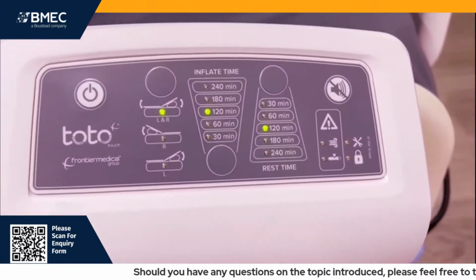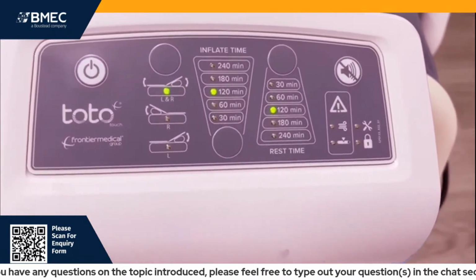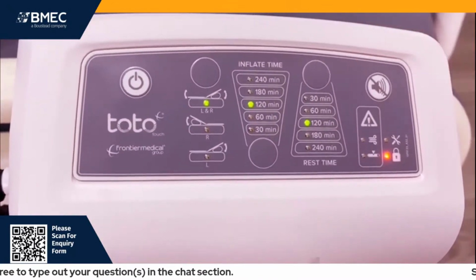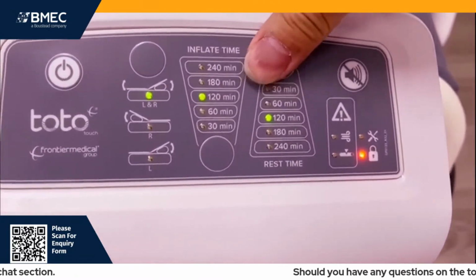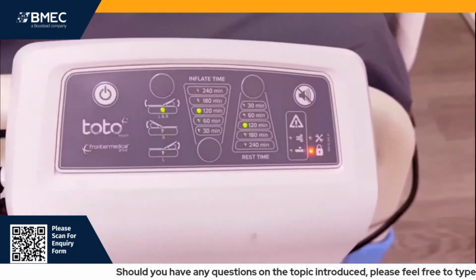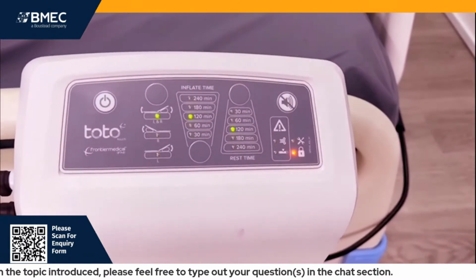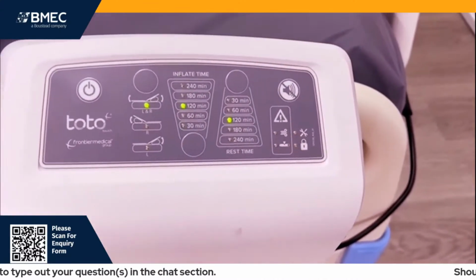It happens when the pump detects an air leak and they will show it, the alarm will ring. So simply pressing this would mute it. Long pressing it would also help to lock the button as well. So by long pressing, other buttons wouldn't work. It would be good to lock to prevent people or patients accidentally changing the settings that you have already set. So long pressing it would also deactivate the lock button itself.